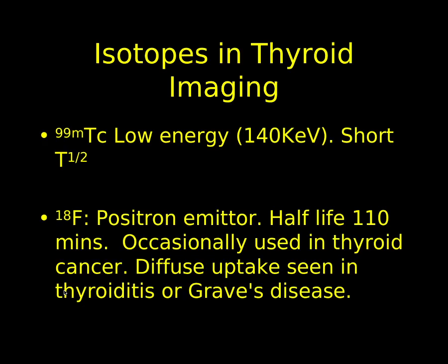So what non-iodine isotopes do we use when we're imaging the thyroid gland? Well, our commonly used isotope in the department, which we will have readily available, technetium 99m, which of course has an energy emission of 140 keV and a short half-life of 6 hours. Now, we don't have to link technetium with a pharmaceutical to get it to be taken up by the thyroid gland.